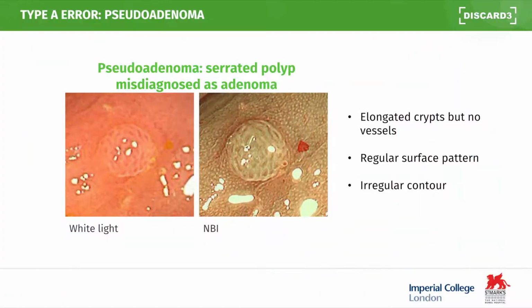But talking about the microstructure of the lesion, what are we actually seeing there in that tubular structure? For a pseudoadenoma, which is a term that we suggest, the surface pattern is similar to a true adenoma, but there's a lack of the capillary network that surrounds the crypts. And so optically, pseudoadenoma is in fact the inverse of an adenoma, and that is that in an adenoma, you have crypt openings within a white structure.